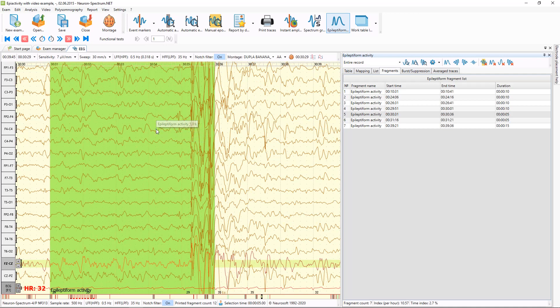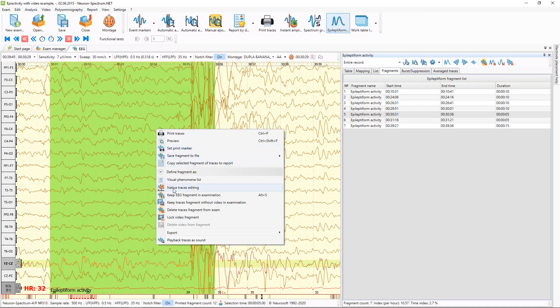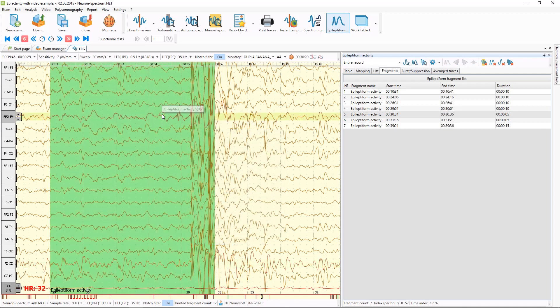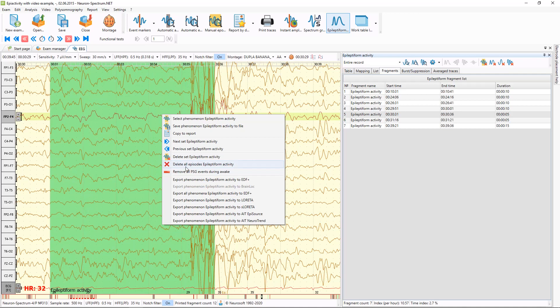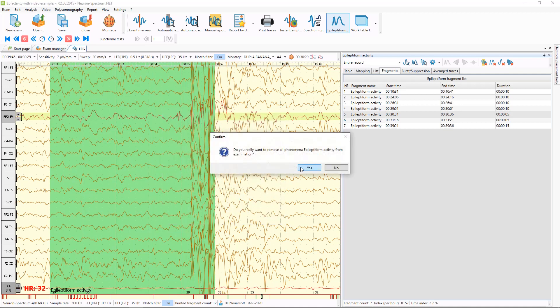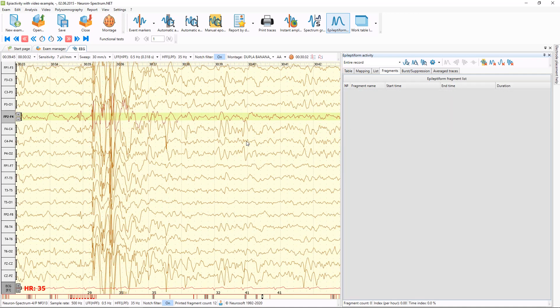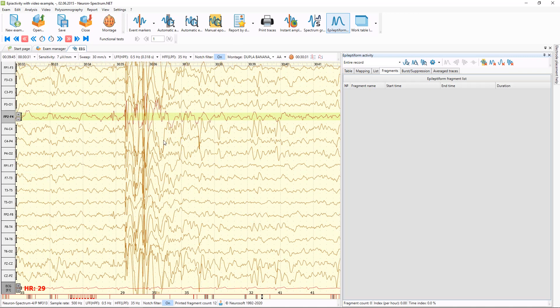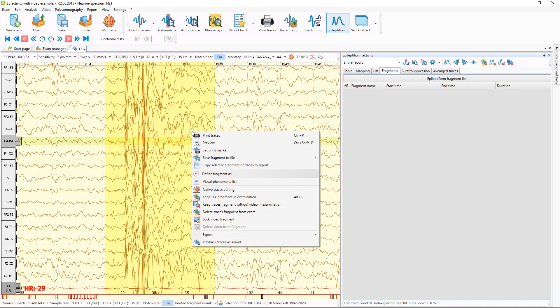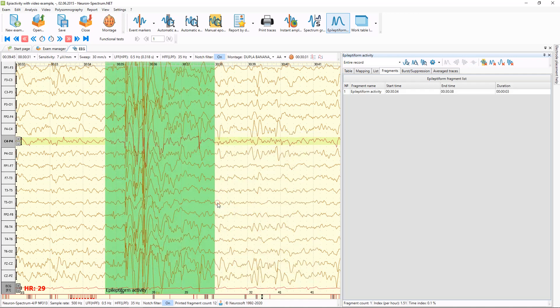I can agree or disagree — for example I can remove this episode and not agree that this is epileptiform activity. Or I can mark it manually, and it will also appear in my list.